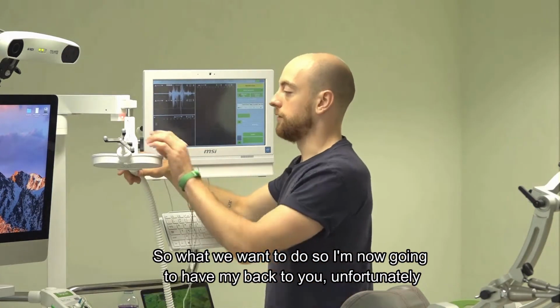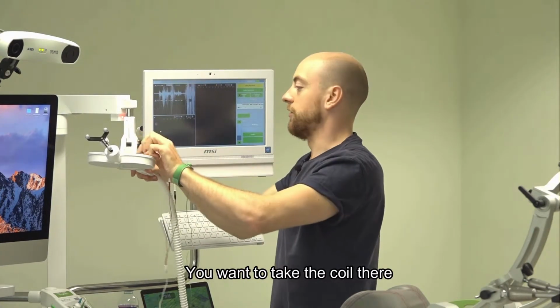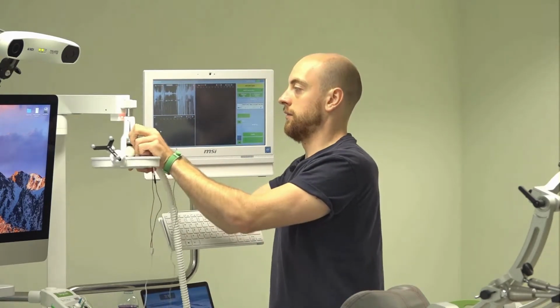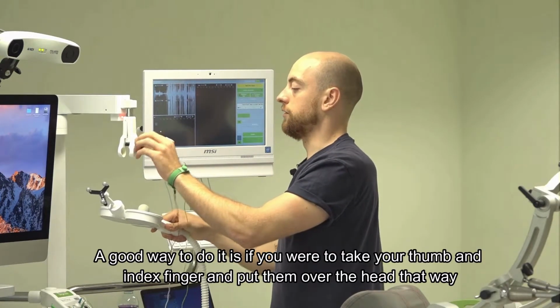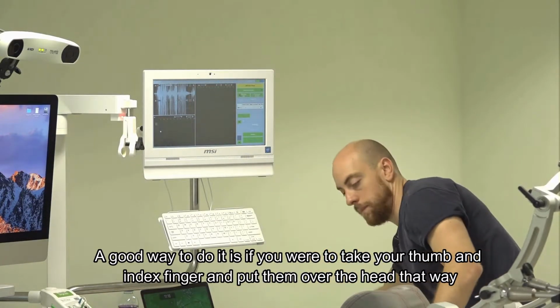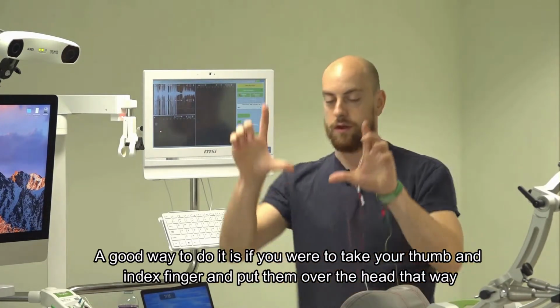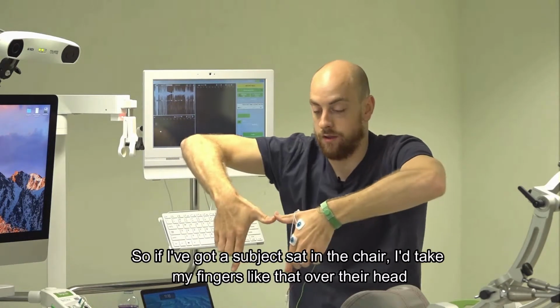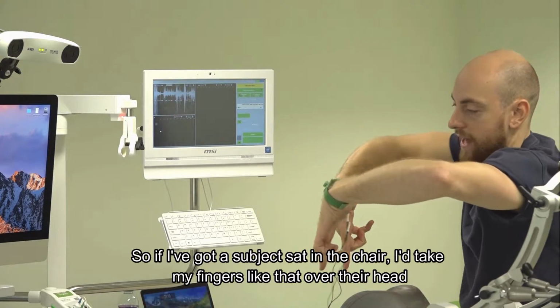So what we want to do, I'm now going to have my back to you, unfortunately, is take the coil there. Now, when we're trying to find the motor cortex, a good way to do it is to take your thumb and index finger and put them over the head that way. So if I've got a subject sat in the chair, I take my fingers like that over the head.